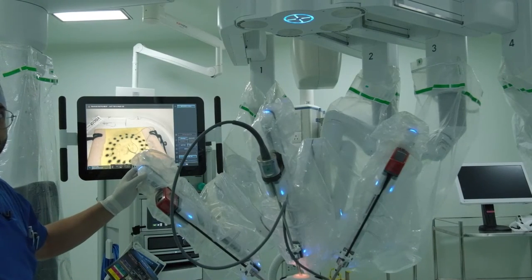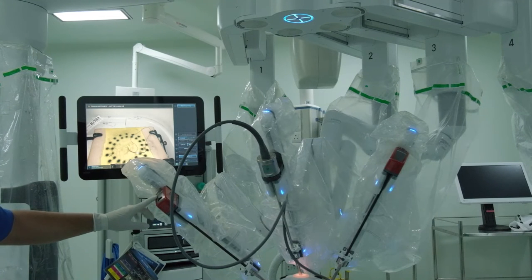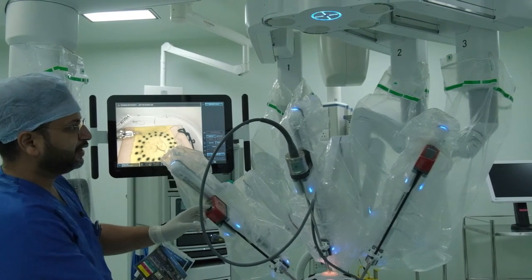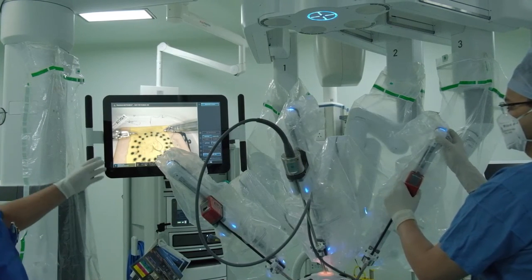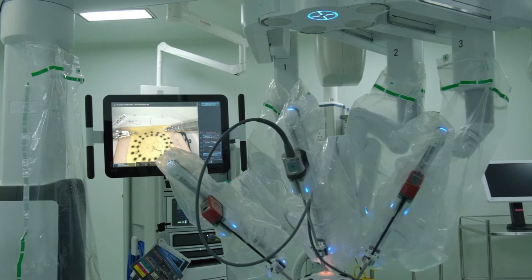So once the robotic system is docked, we put in the instruments and then we push them under vision into their position. You can see the Maryland grasper has come and Dr. Tushar is going to push the needle holder into view, and now both the instruments are into view. Then we can go to the surgeon console.